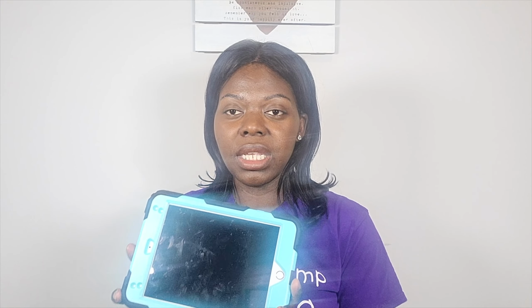This one is for Jaleesa. She knows that this iPad doesn't have anything else on it. It doesn't have YouTube. It just has the app that she uses to learn. And I think it's really important to separate what they use for play from what they use to learn or speak. That way they know that when they pick up this iPad, that's all they're doing with it, it's for speech and nothing else, because that can influence how they want to use it. If they have it on the same device as YouTube, kids will go on YouTube and watch stuff. But we wanted her to know that this iPad is only for speech.